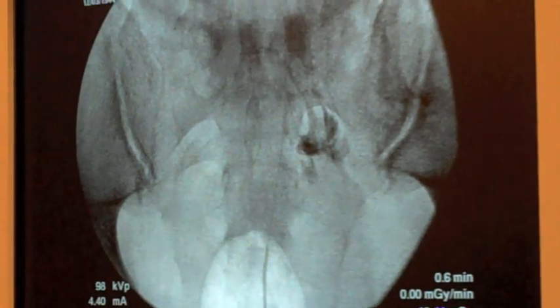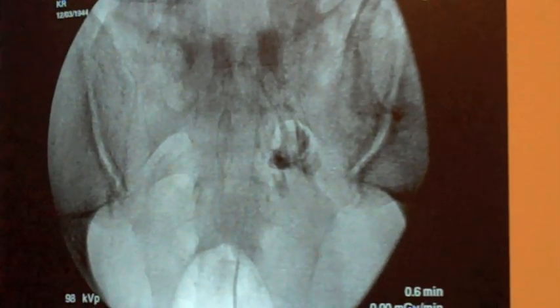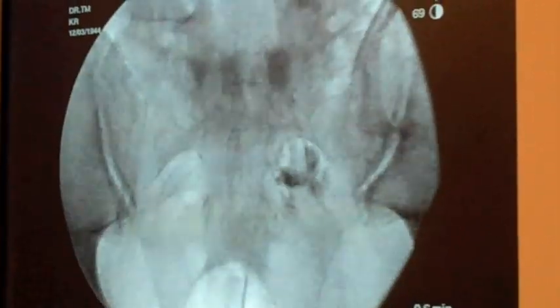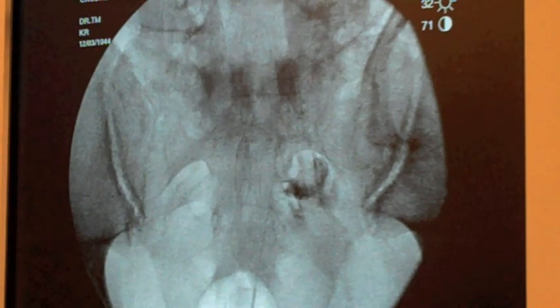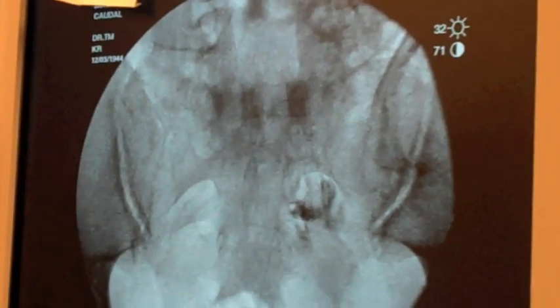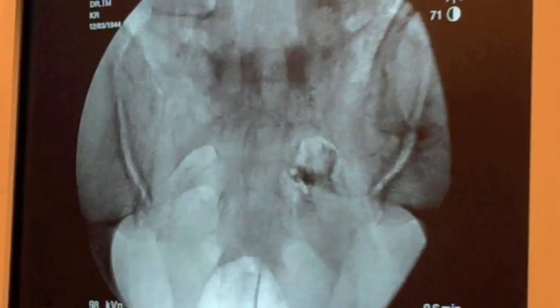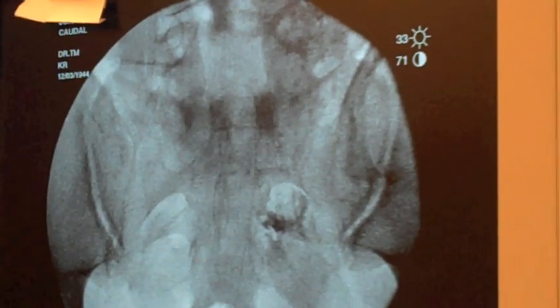Now I'm going to put in some of the enzyme type medication. You can see that medicine spread as well. One more bit of medicine here — it will spread all along those nerve roots up there.